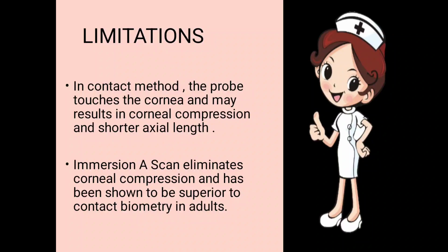Accurate axial length is very important to do the biometry or to give the proper lens power. So corneal compression should not happen. To avoid this, we will use the immersion method, because in this case there is no corneal compression. So mostly the immersion method is used.